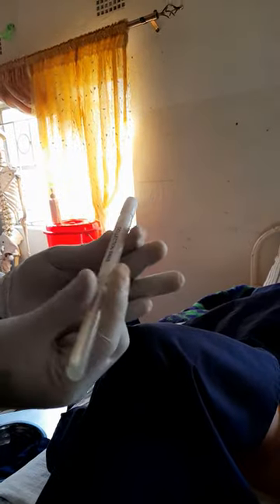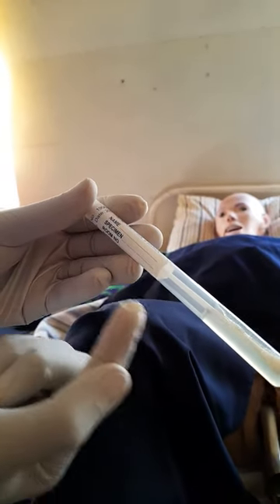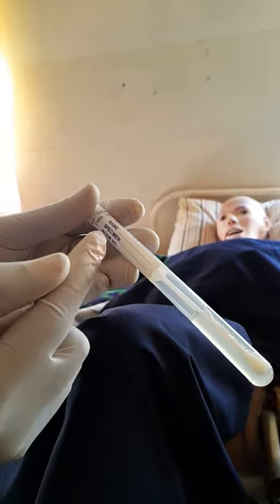Once the swab has the discharge, bring it out, open the transport media container, and place the specimen into the transport media. Close it tightly. Then label it: write the patient's name, the type of specimen — HVS (high vaginal swab) — and the room number and today's date.